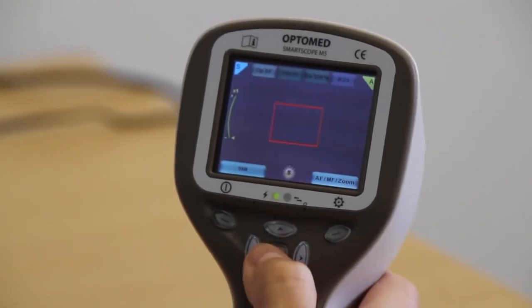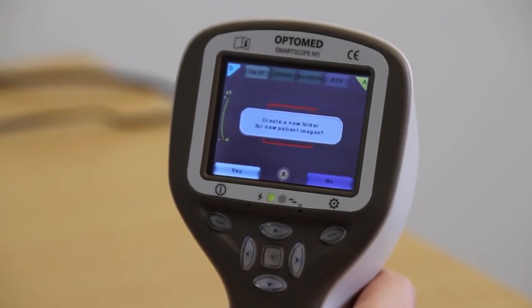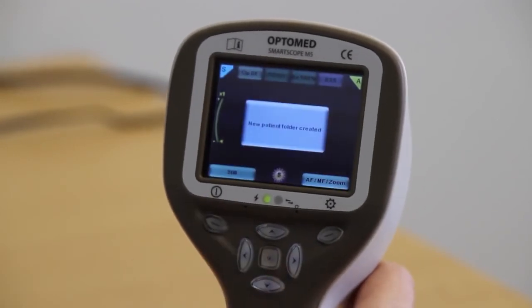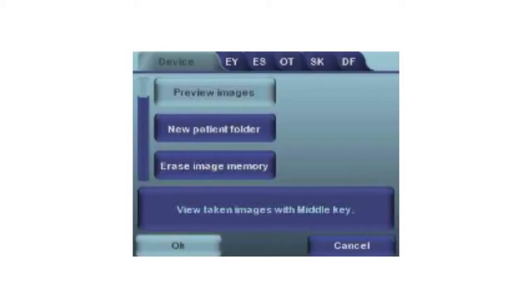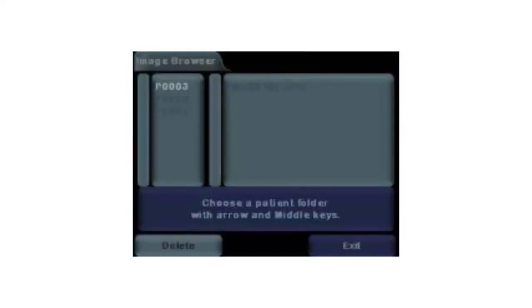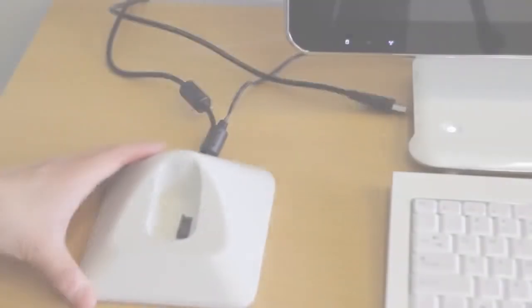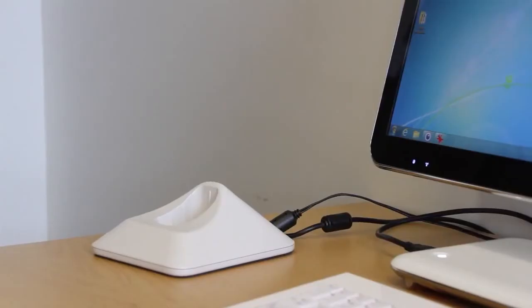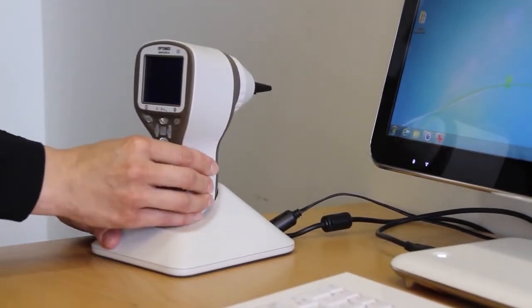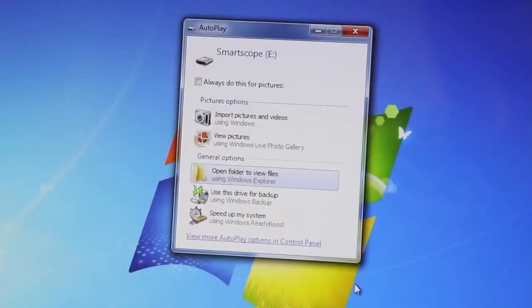If multiple patients are examined during one session, create a new file folder for each patient by pressing and holding the middle key. If you want to preview images, go to the device menu and select Preview Images. The most recent image will be at the top of the file folder. Images are uploaded to a computer by placing the camera in the cradle. Image transfer works through USB connection in a similar way to any other digital camera.